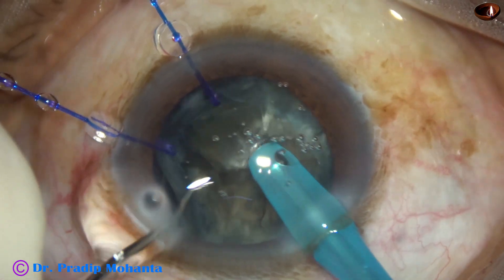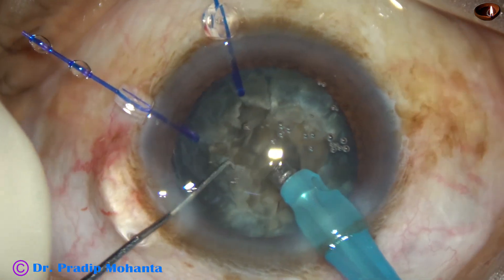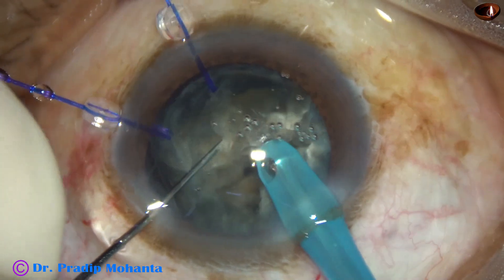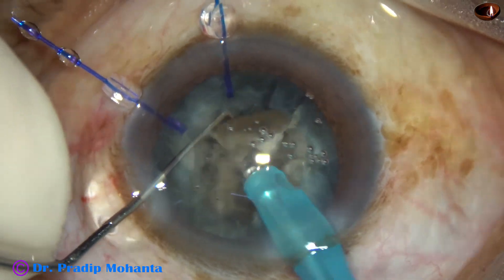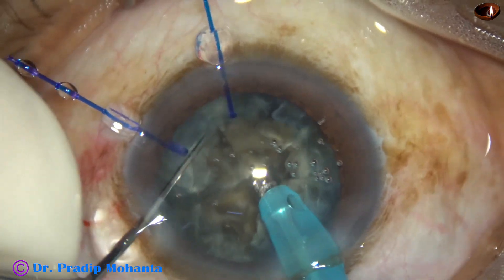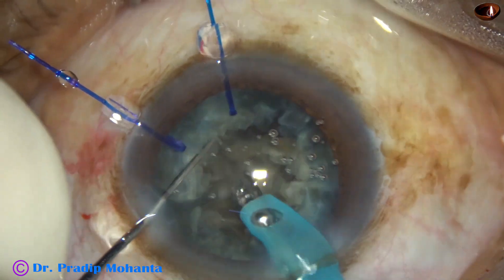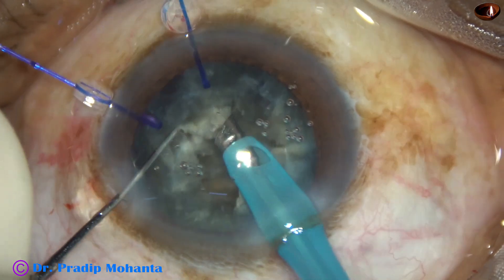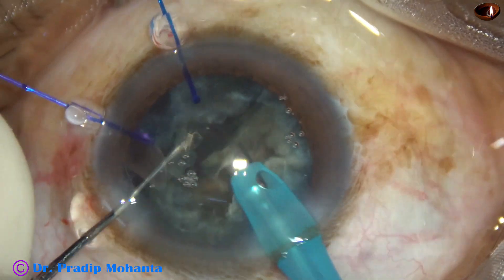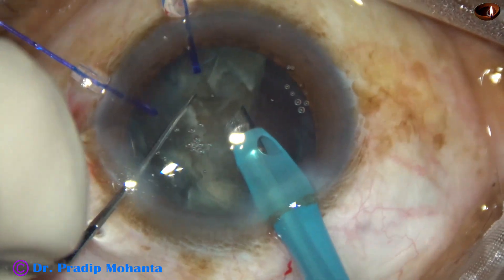Finally, I increased the vacuum to about 200 and flow rate to about 30, and I could manage the nucleus with this slightly higher setting. This surgery took a very long time — about 40 minutes — and is being shown at 1.5 times speed. It has been edited to about 14 minutes, so you will need patience to watch this surgery.